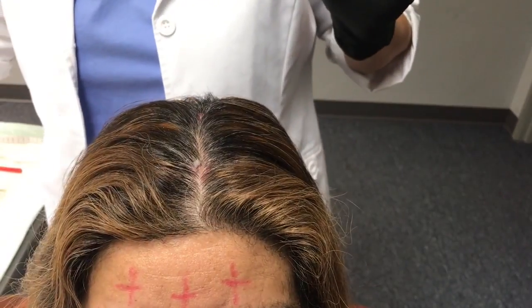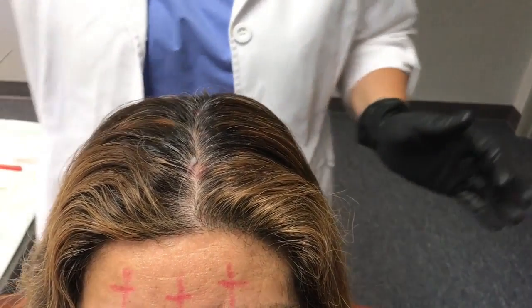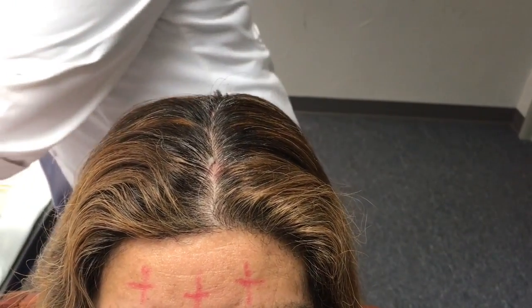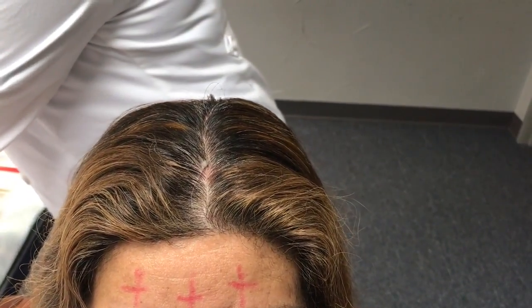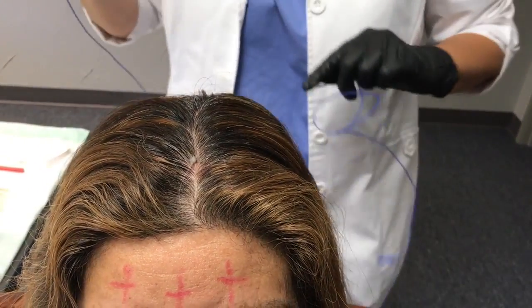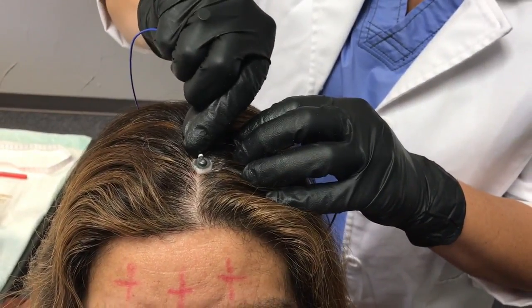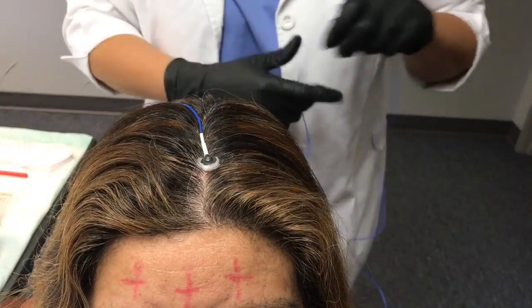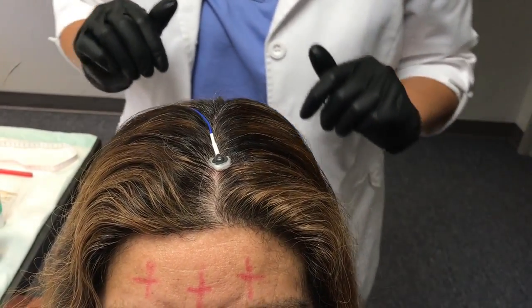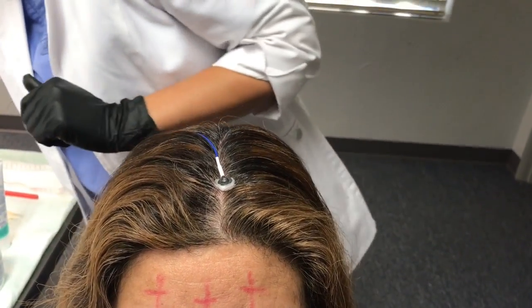You'll repeat this step for each mark that you've made. Next, we'll fill the electrode cup with 1020. Do not overfill the electrode cup. Applying too much paste will spread the conductive paste and could result in asymmetrical EEG signals. We're going to place the EEG electrode on the marked spot and apply a small amount of pressure.